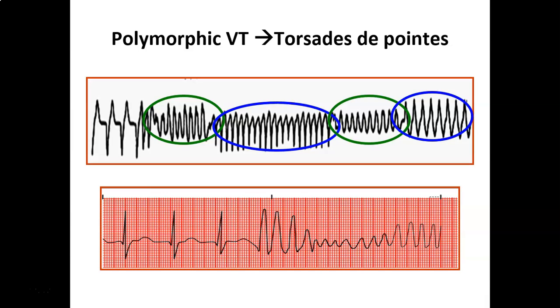It's very important to try to differentiate Torsades de Pointes from the normal polymorphic ventricular tachycardia. For this, you have to try to find the patient's previous record. If on ECG you find that the patient has long QT interval in the previous ECGs, then this polymorphic ventricular tachycardia you are encountering, with a previous history of long QT interval, is Torsades de Pointes.